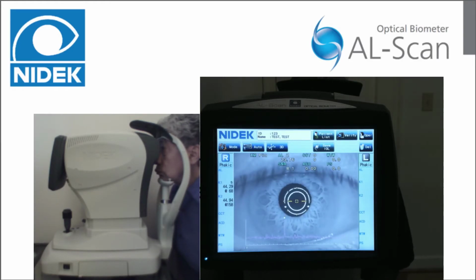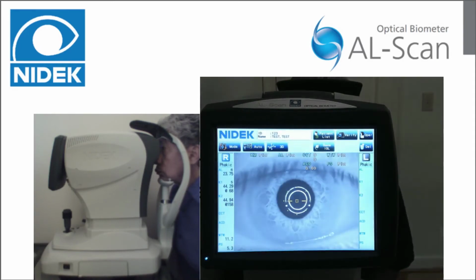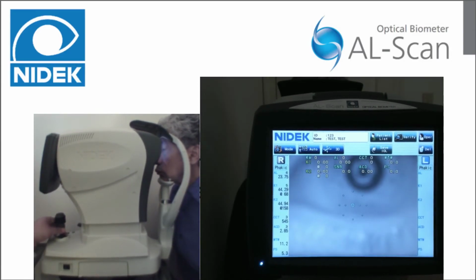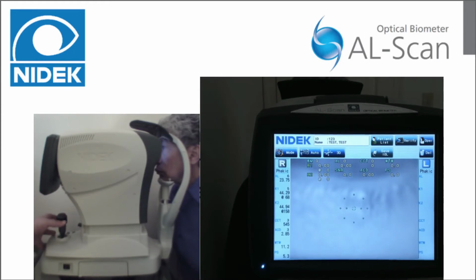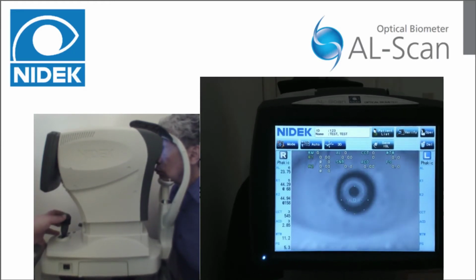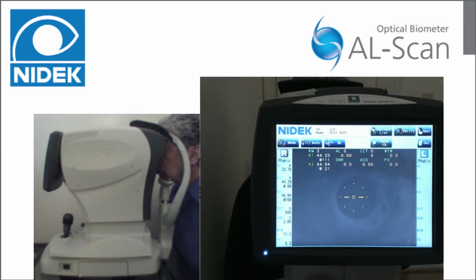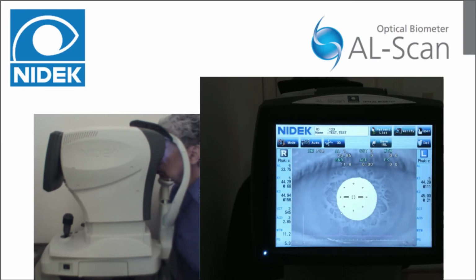Move the joystick so the patient's eye is on the screen and move towards the eye. The auto alignment will engage and take control. Continue to inform the patient to look at the red light and hold still. The measurement will begin once the alignment is correct. Repeat steps for the other eye. After complete, tell the patient to sit back and relax.